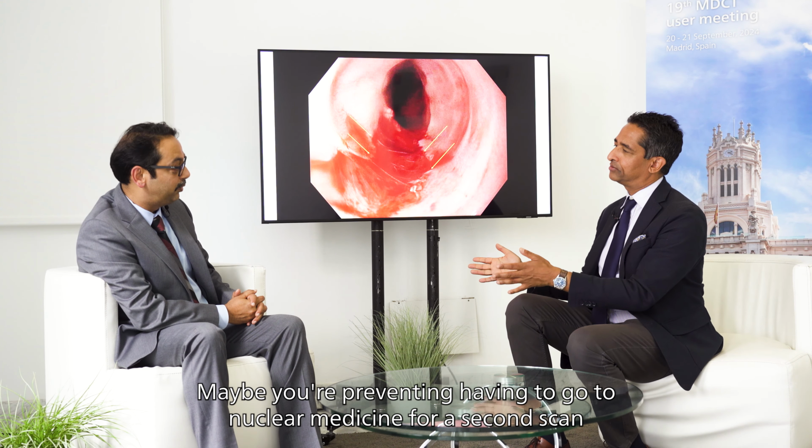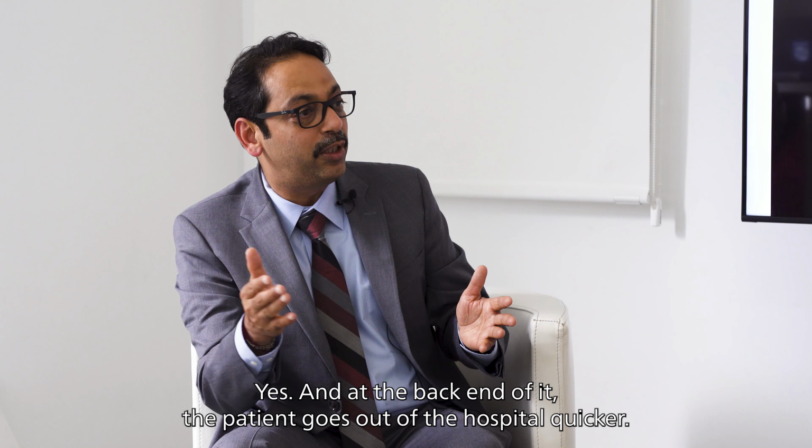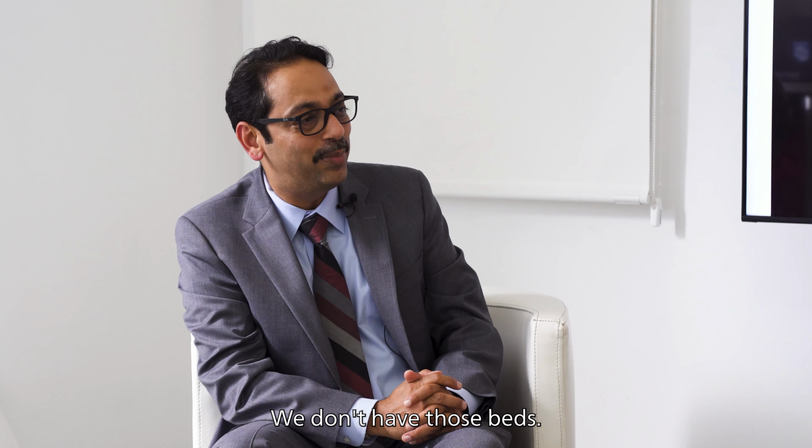Maybe you're preventing having to go to nuclear medicine for a second scan or a repeat CT using a different protocol. It sounds like you're really speeding up the process. Yes, and at the back end of it, the patient goes out of the hospital quicker. Right, and hospital days we know are precious. We don't have those beds.